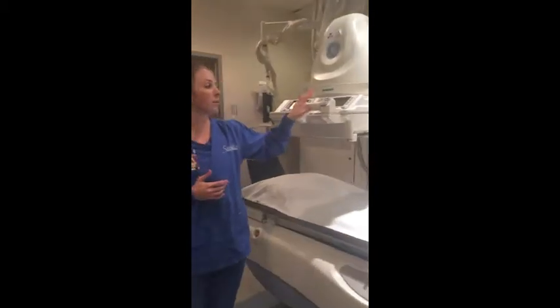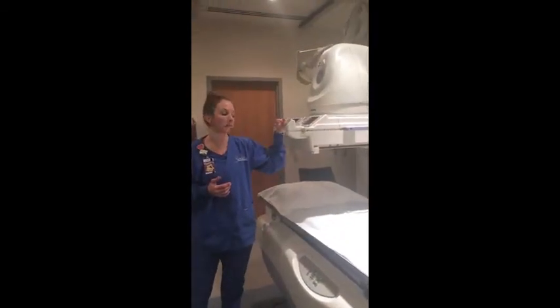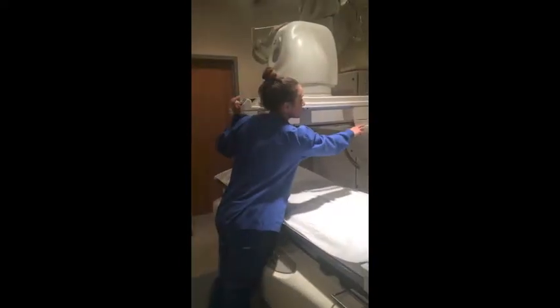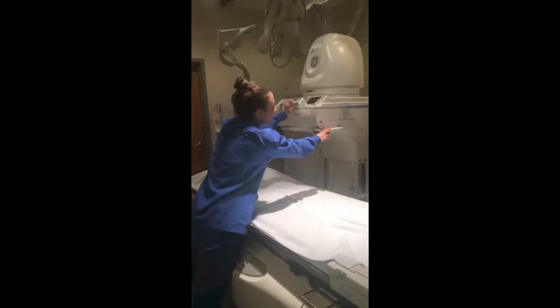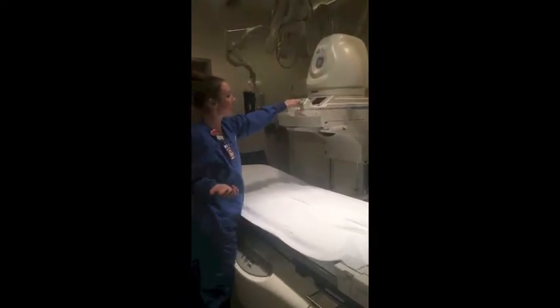The only thing that I really want you to focus on for the tower is that it can move up and down, so make sure that you're aware of that. Okay? And then if you want to move it forward or left and right, you can use this handle. You'll push the handle down, and then you can push the tower all the way back until it locks into place. After that, you can keep it there. Okay, it's not going to move.